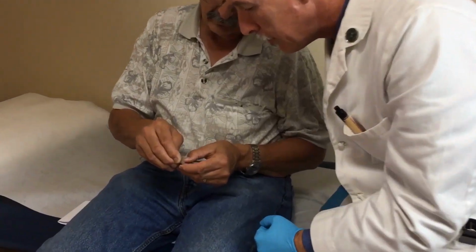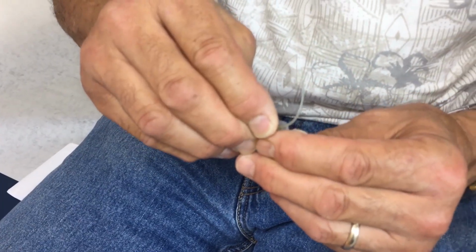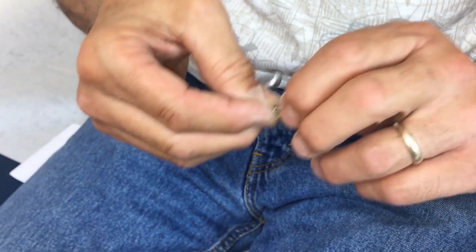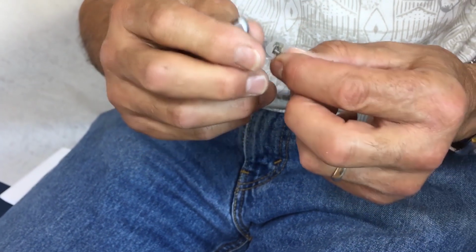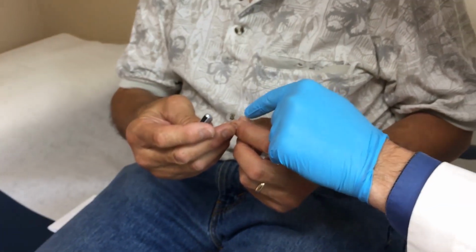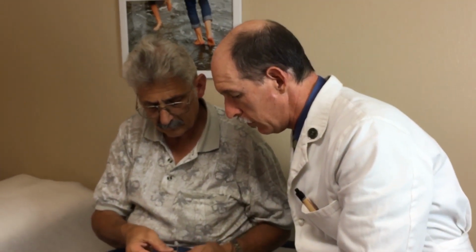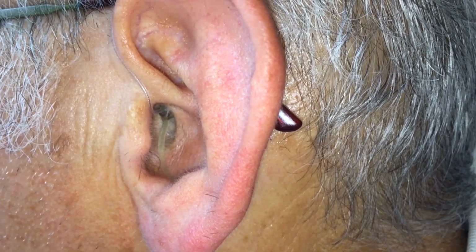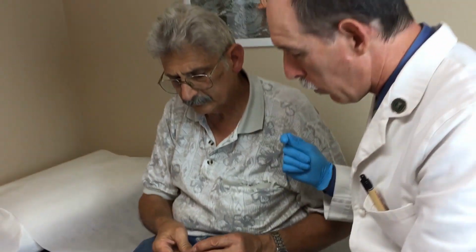They slide onto this little square device, but I don't know whether it latches on or if there's a groove to hold it in place. But when I put it in my ear, maybe I'm pushing too far in. We should probably also check with whoever services these for you, to see if they have some advice for helping keep them from coming out so we don't have to do this. It's ReSound. Do you get that from a local? No, it's mail order. Oh, okay. We may have to check with the company to see if they have a way of keeping them from coming off. For now, try not pushing it in quite so hard and see if that helps.